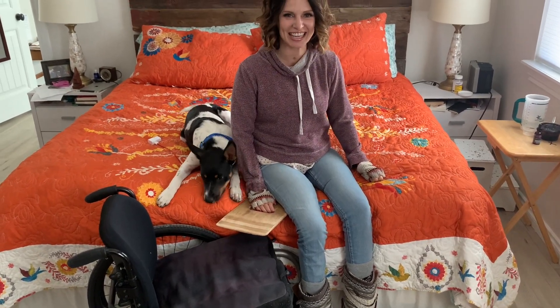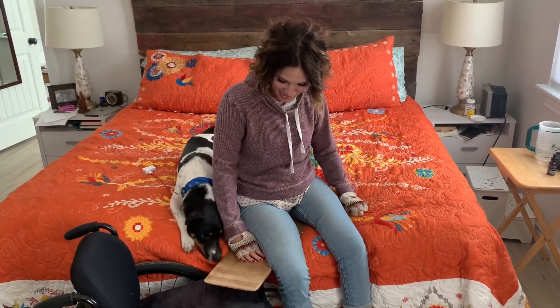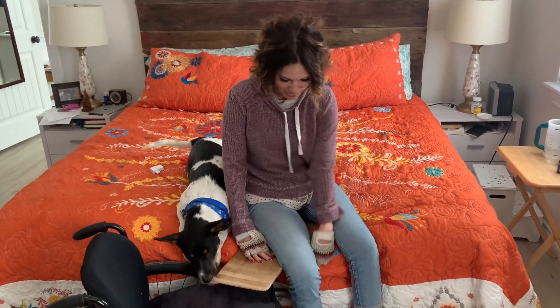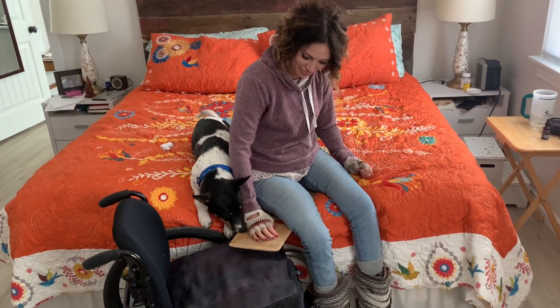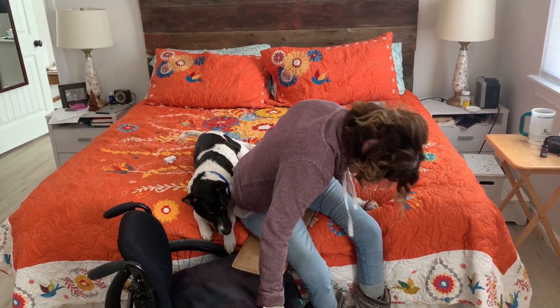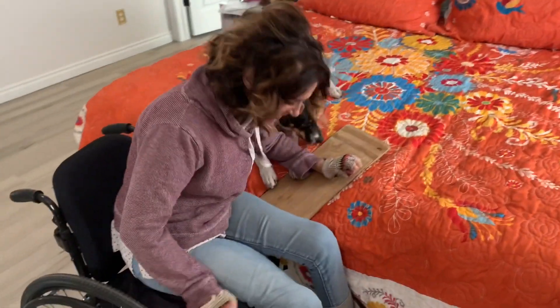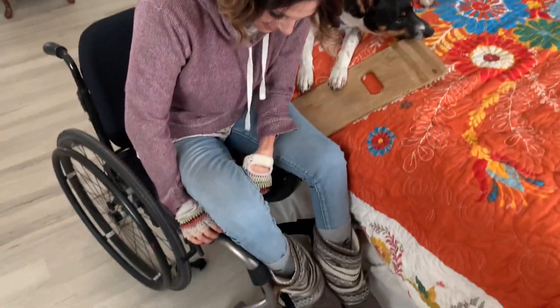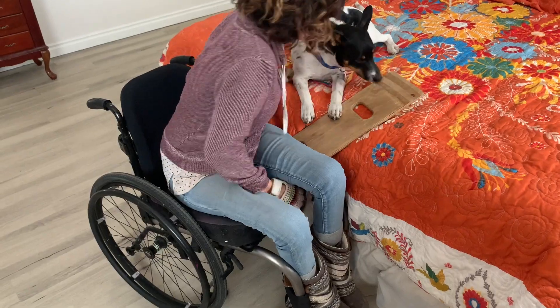This is not how it's done. You're a good dog. This video should be called: How a Quadriplegic Defies Death to Exit the Bed. Move your face. Ta-da! Don't lick my board. So, that is how it's done.